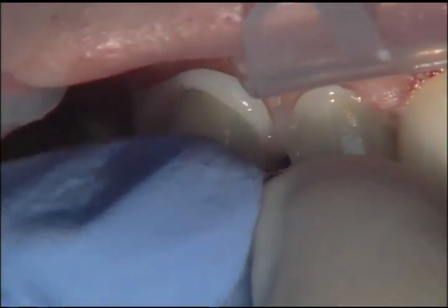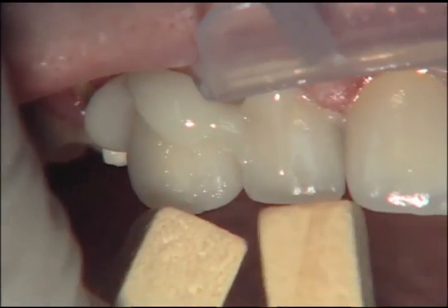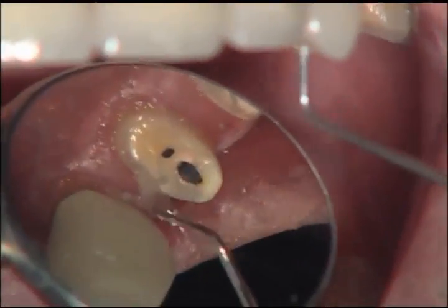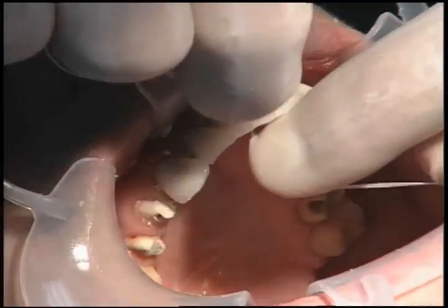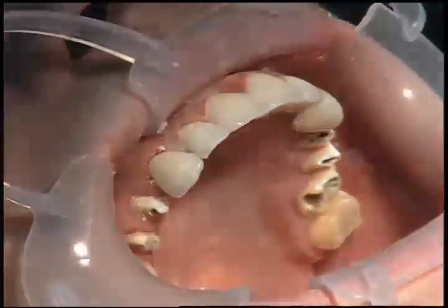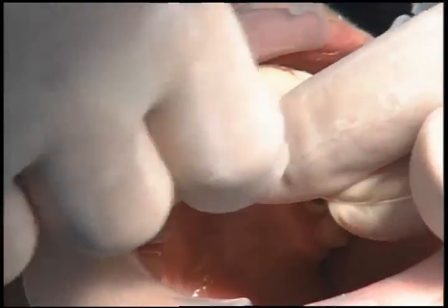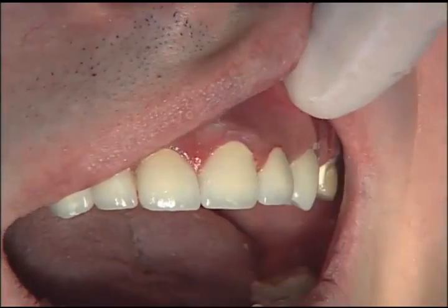Now we move to the other side and we're putting on teeth number 6 and 7, again with the orange wood sticks whenever I can, and then my assistant comes in with the spot cure to get it to its gel stage. We clean up the excess cement from the facial. You can see I'm using the explorer just to clean off some adjacent teeth. It cleans off nice and easy. As you're cementing segmentally like this, if there is any excess cement that runs onto the bicuspids, go over and clean that off before you try in the next unit. You'll notice that a unit that fit at try-in then won't fit when you go to place it if cement has hardened on an adjacent tooth.